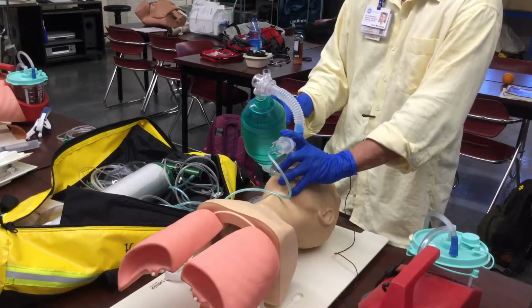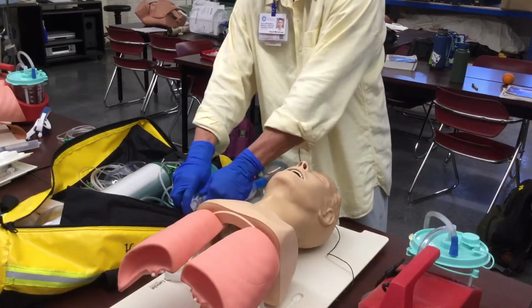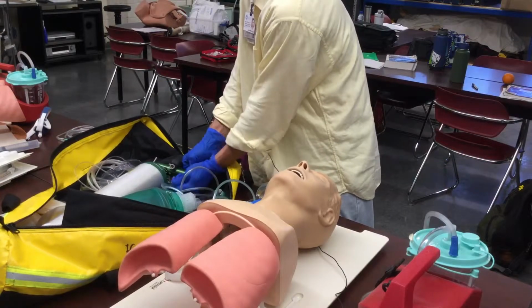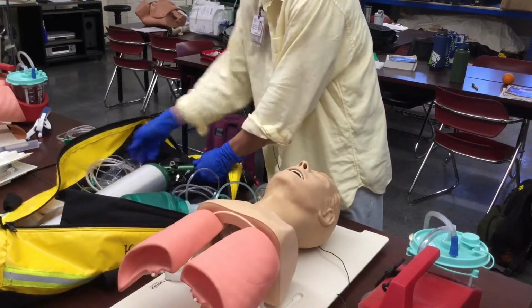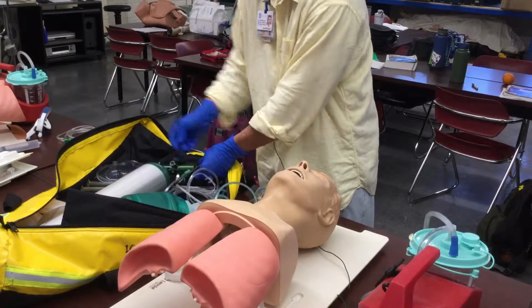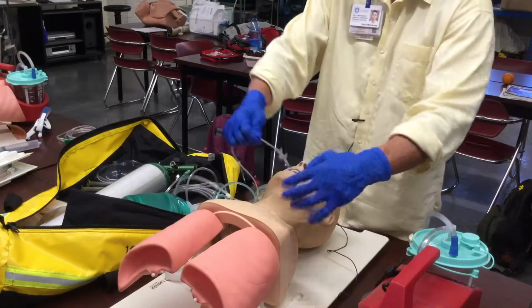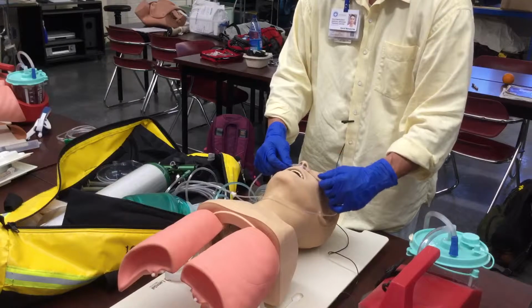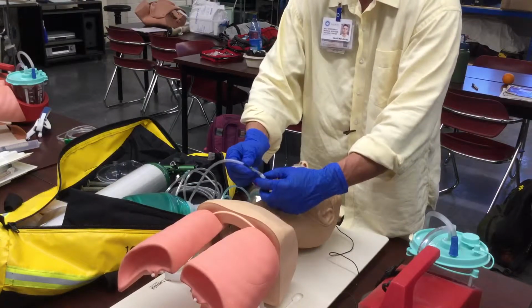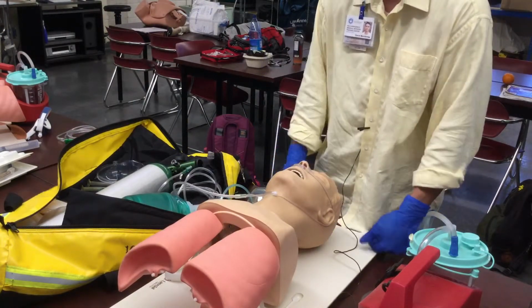So I assume the patient now is getting better, and the treatments that we've been giving to open up the airway have done their job by reducing the bronchospasm. Patient is breathing spontaneously, I assume, and so we can discontinue the oxygen by bag valve mask and set this at a liter flow rate of 2 to 6 liters. We'll go ahead and start off with 3 liters, slightly above the 2. Nasal prongs follow the natural passageway of the patient. We're going to put the tubing around the ears and then draw up on the drawstring portion under the chin. Making sure we're at 3 liters, and watch our patient's respiratory effort, rate, and rhythm.